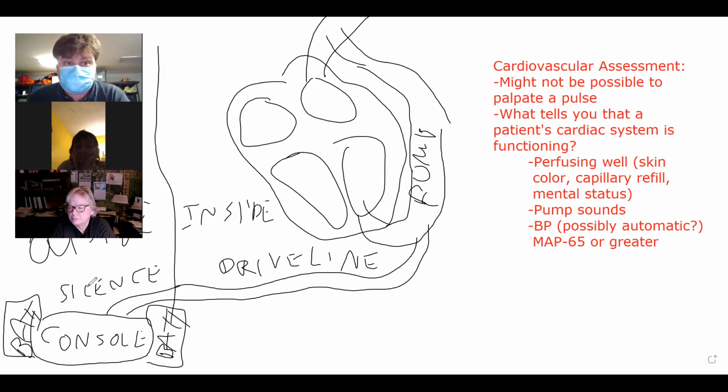I'm not sure that's a universal feature. There are 3 or 4 models of ventricular assist device on the market, and they're made by a couple of different companies, but some do offer direct charging as an option. It just wouldn't be a good option for a prolonged period of time.